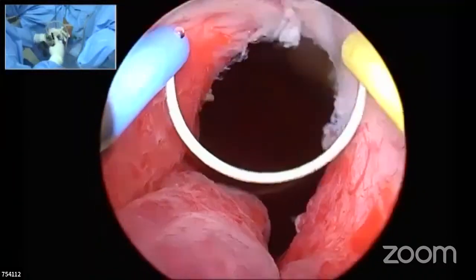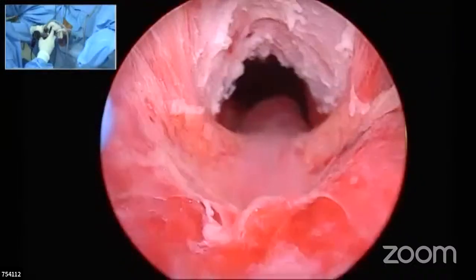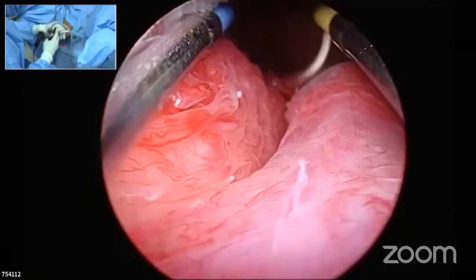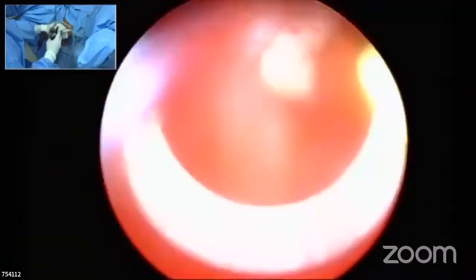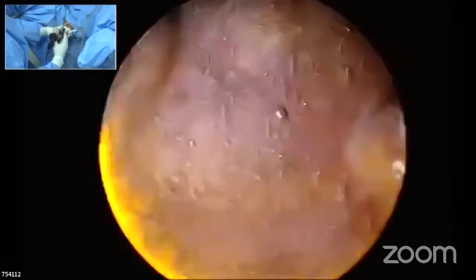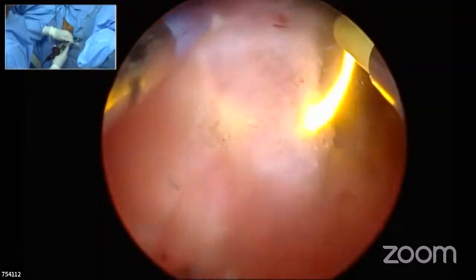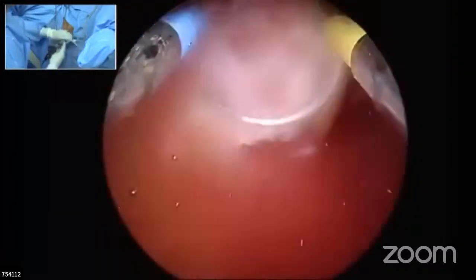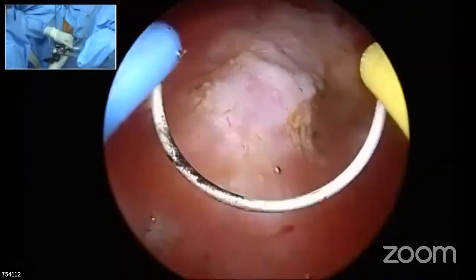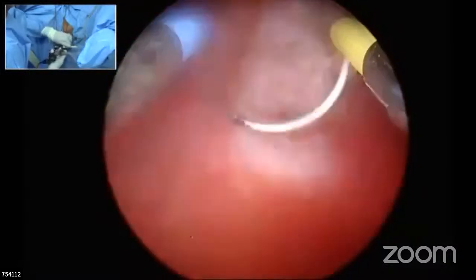All my mucosa from the verumontanum down to the area of the pelvic diaphragm is intact. So this length is actually a reason for good continence, and even for avoiding stress incontinence. It is not the levator which is necessary for stress incontinence, but this lissosphincter is necessary for avoiding stress incontinence. So having done all the things, I think I've resected completely.